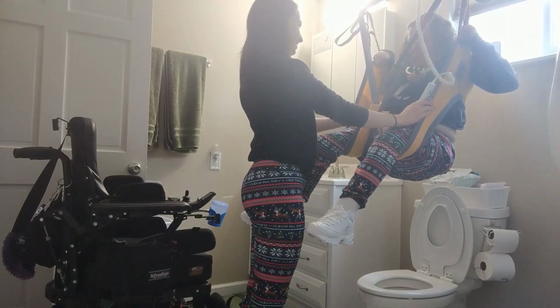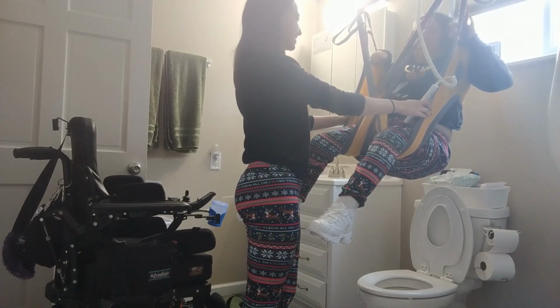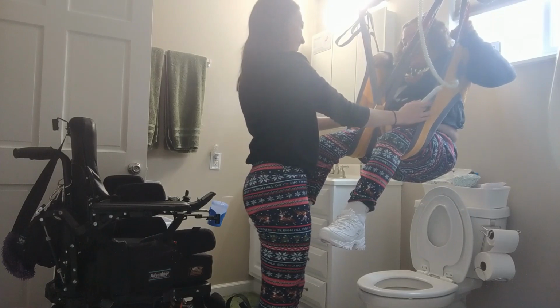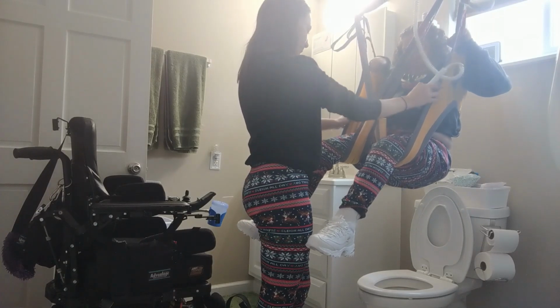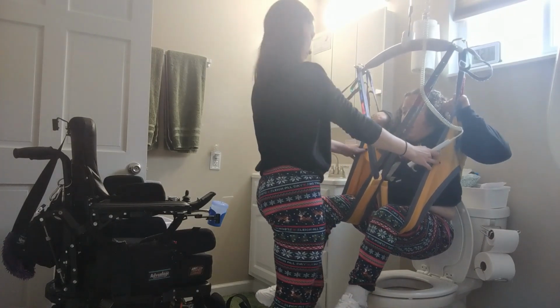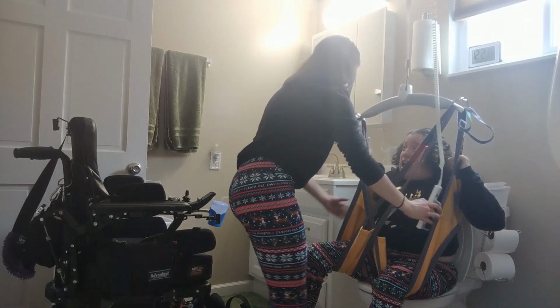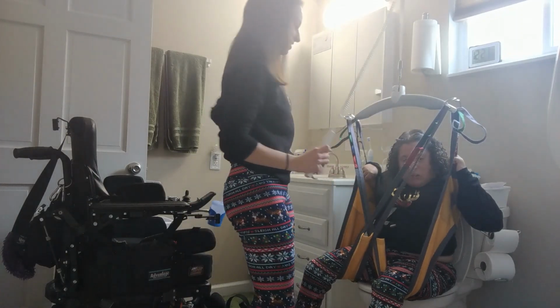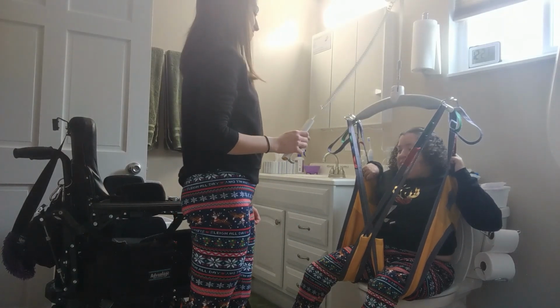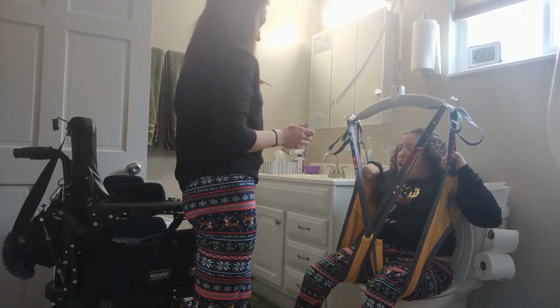So typically, Ari would now pull down my pants and my underwear, but we'll just leave that to the imagination. And then we lower down on the toilet. Make sure you push her back far enough so she's not leaning way back on the toilet. Right, because you want to make sure things get in the toilet. And then ta-da! I do my business, which, fa la la, you can just imagine that again. So just sing a Christmas carol in your head instead. And so we wait for me to do my business. I tell someone I'm done. So hey Ari, I'm done. Alrighty, let's get you up.